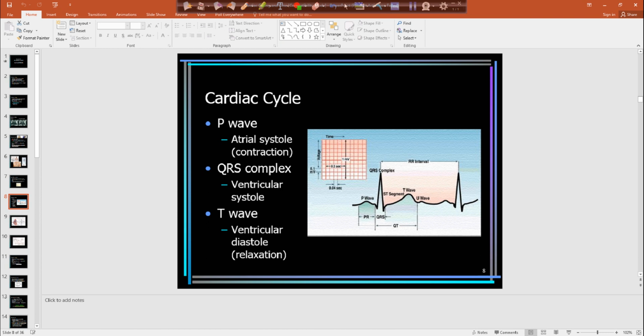So they're creating more of a fluctuation in that wave than an atrial contraction. So this is our T wave, where the ventricles are relaxing, filling back up with blood. And remember, we're trying to time our pulse sequence with this wave.